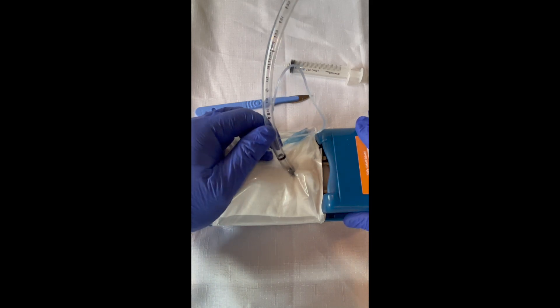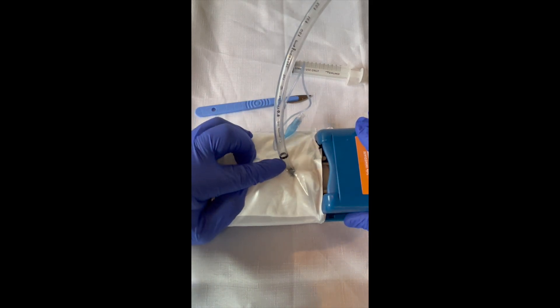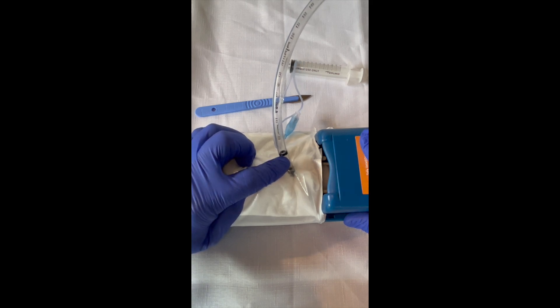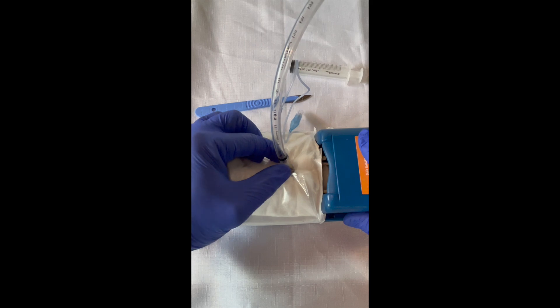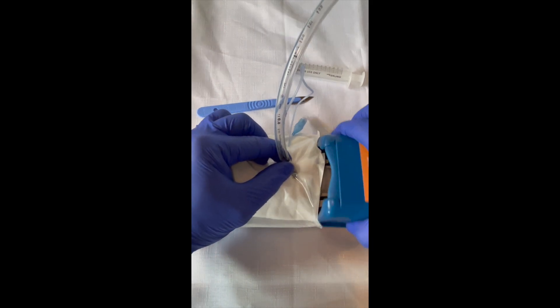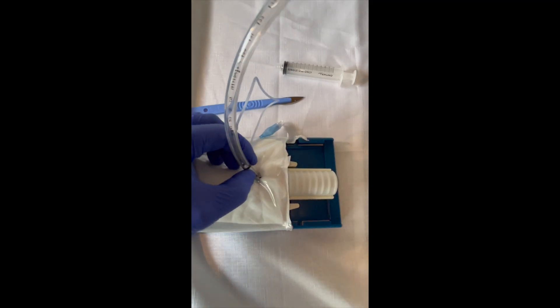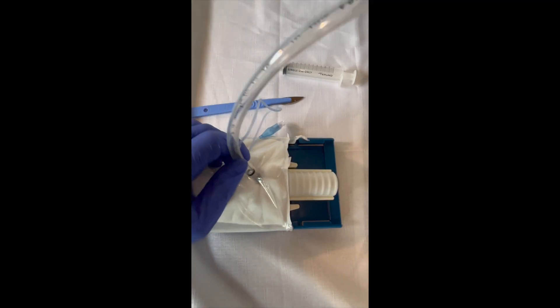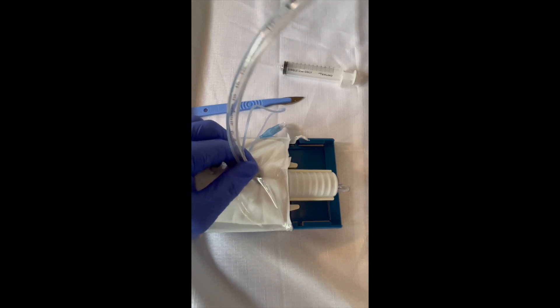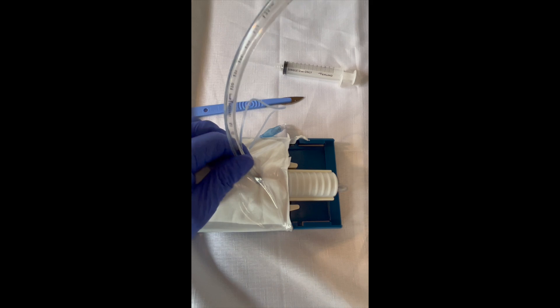We can check the depth of our tube. We can still see one of the ETT markings here, so we're probably good — we've just seen the balloon disappear, no deeper. We can confirm and have a look. It's not beyond the carina. A lot of people push it in too far and we end up with a main stem bronchus. Usually we can see something here to know we're in the right spot.